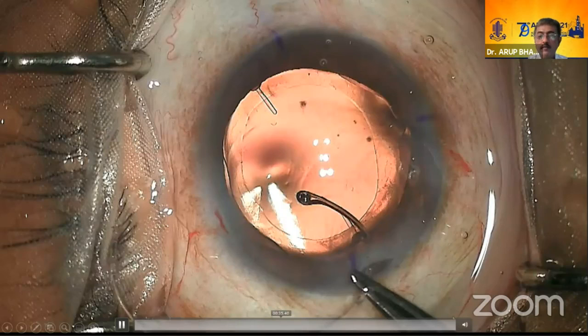So one should be very careful when you rotate the lens. If there is any resistance, inflate the bag. Otherwise, if you don't find any resistance, don't inflate the bag, then it will be more stable postoperatively.